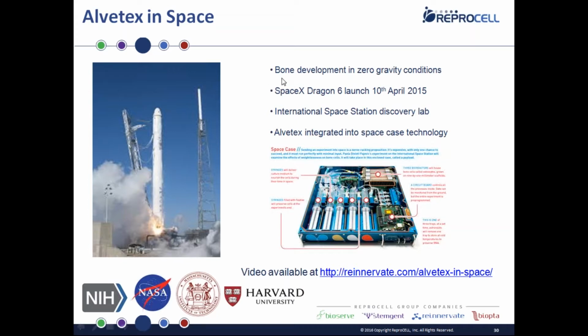So we were very lucky to collaborate with a lab that was involved with NASA. And you can see here we've got that little case with the cells and the scaffold. Medium was being pumped through syringes so it could go through the bioreactor. There was a little bit of fixative in there, so at the end of the experiment the samples could be fixed and then analyzed later. So it's a very complicated and a very sophisticated piece of kit, and we're very privileged to be part of it. It was very exciting for us, and it's something that excites customers a lot.